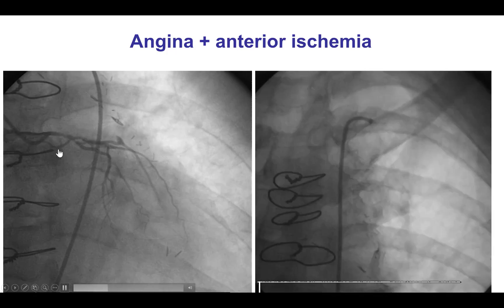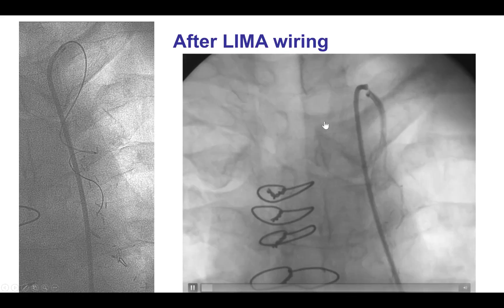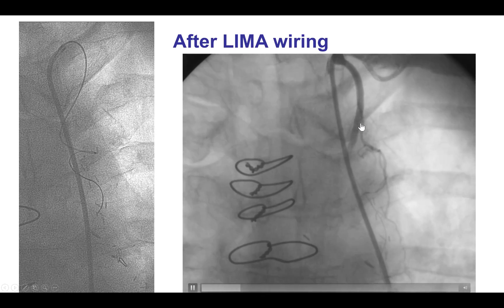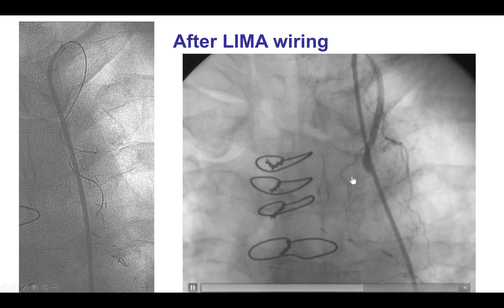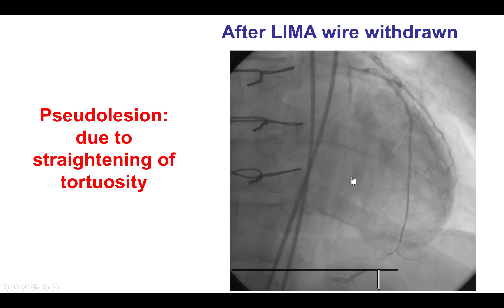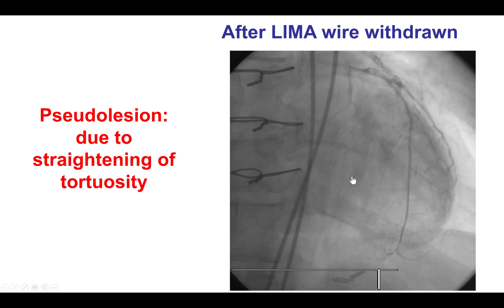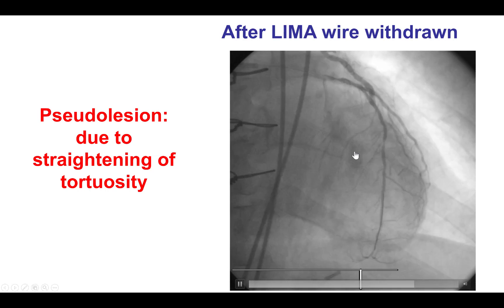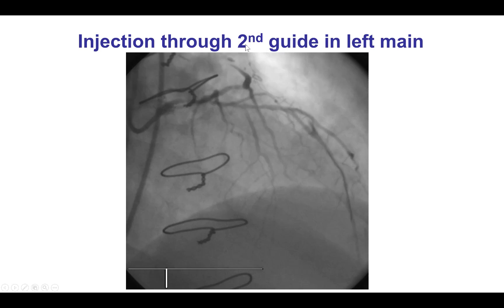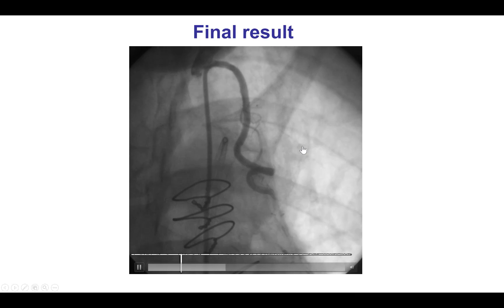This is an example of a patient with previous coronary bypass. Angiography demonstrated a lesion in the mid-LAD distal to the touchdown of the LIMA. We tried to deliver a wire through a microcatheter from the LIMA, but unfortunately that resulted in complete cessation of antegrade flow, raising concern about LIMA dissection. However, upon partially withdrawing the wire, there was restoration of TIMI III flow — illustrating that when wiring through tortuous lesions, straightening of the vessel can cause an accordioning effect and decrease or completely stop flow. In this case, we dissociated delivery from imaging: we imaged from the LIMA but delivered our stents through the left main, avoiding flow issues, and the lesion was successfully treated.